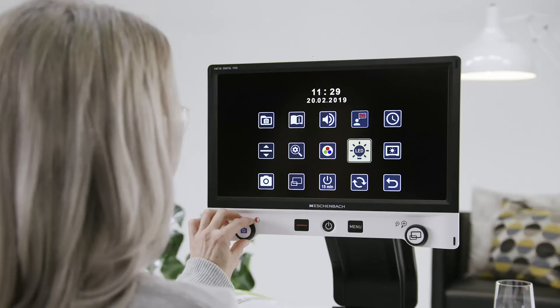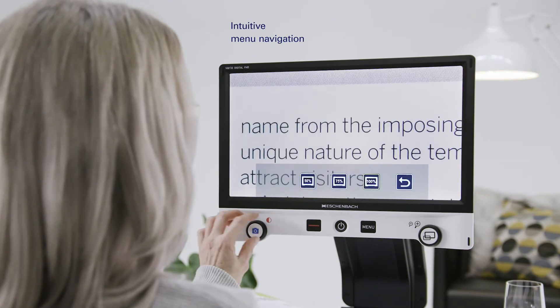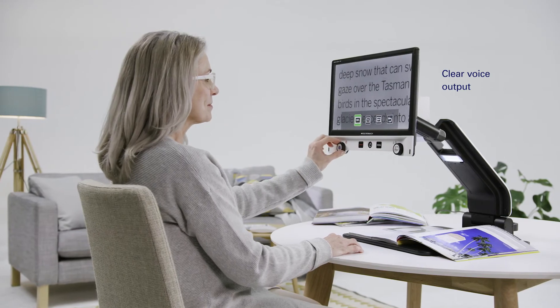Other personalized adjustment possibilities such as screen brightness, display brightness, or voice output of the menu navigation enable you to adapt the device to your needs.